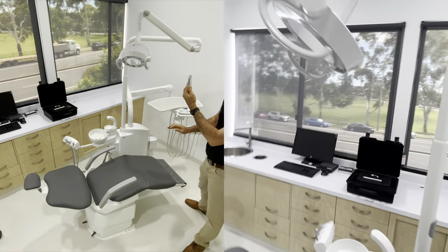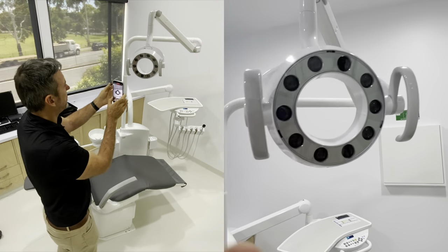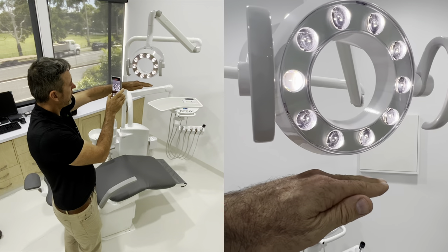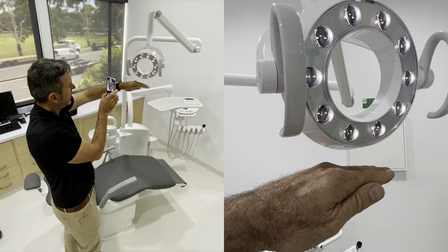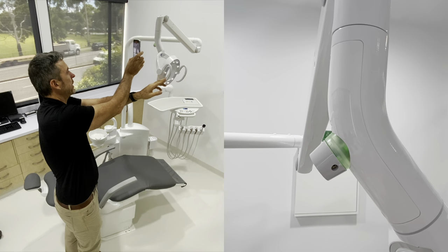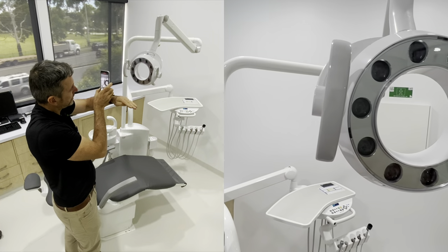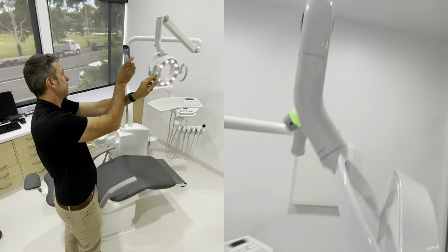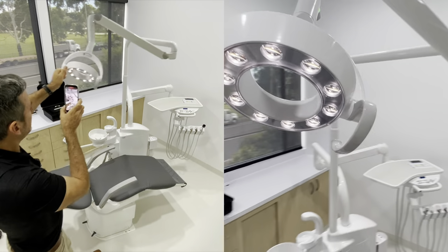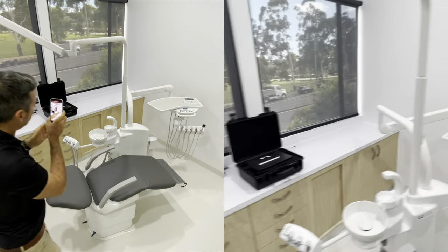So we'll go up to the light now. This is a top of the line 10 LED light from Belmont - it's sensor controlled, just a wave through to turn on and off. If we hold our hand down there, it goes into composite mode so it won't cure your composite - it's flashing to tell us we're in composite mode. You can hold your hand there again to exit, or just turn it on and off to go back into its full state. I find that's the easiest way to go from composite mode back into normal mode.